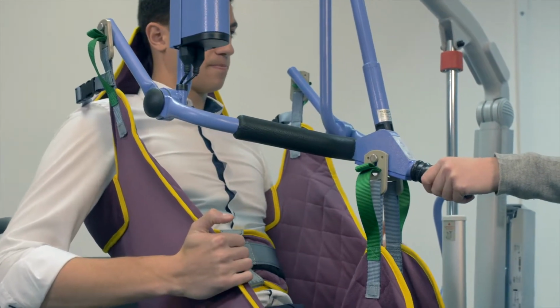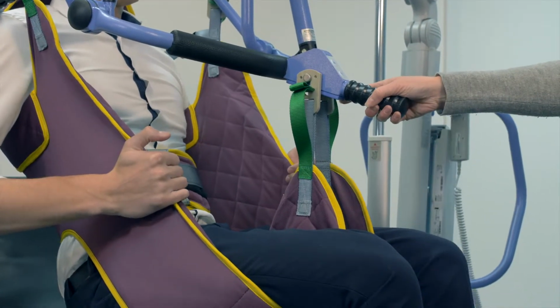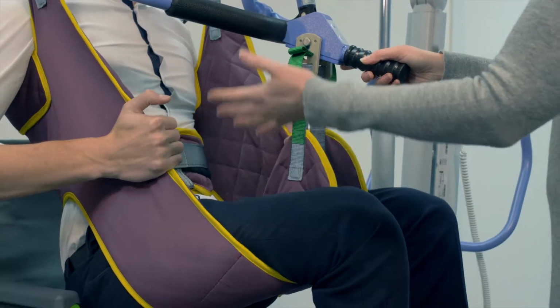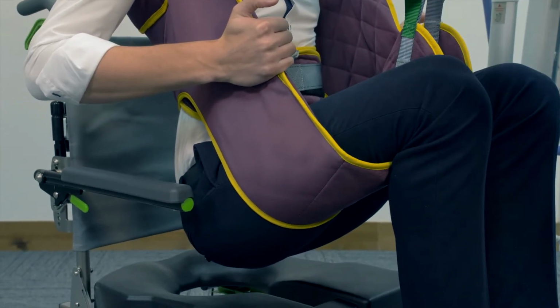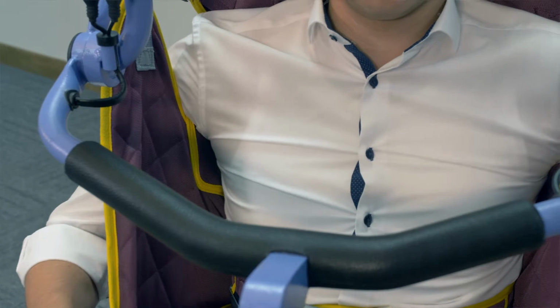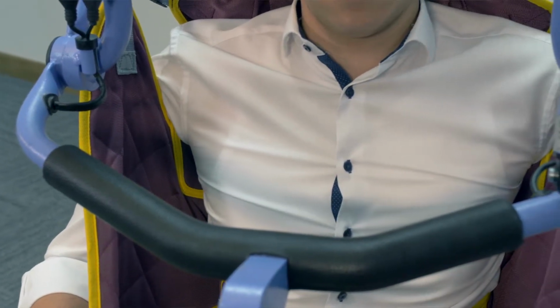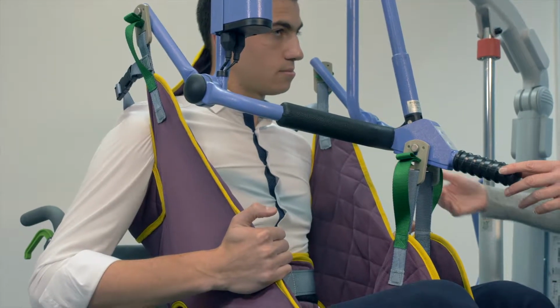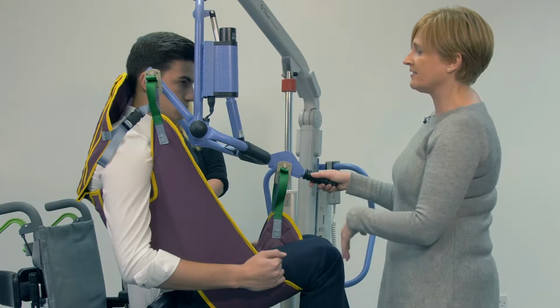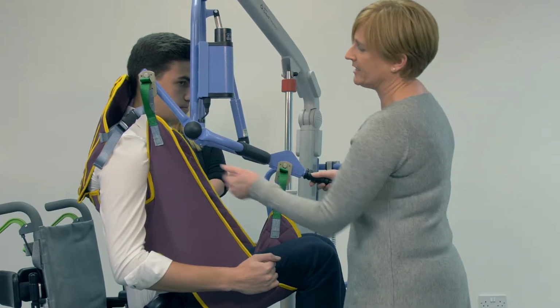If the sling wasn't a suitable sling, then the user is likely to slide through the sling, and then their bottom may well end up lower than their knees, and you're likely to see a lot of force up under the armpits. This could cause problems with soft tissue damage, bruising, dislocated shoulders, and this is going to cause the service user discomfort and pain and possible shoulder injury.